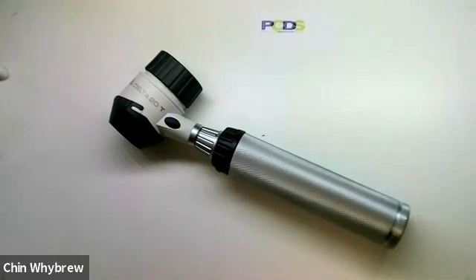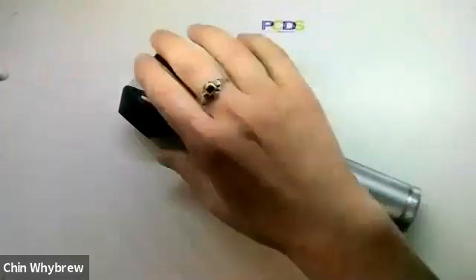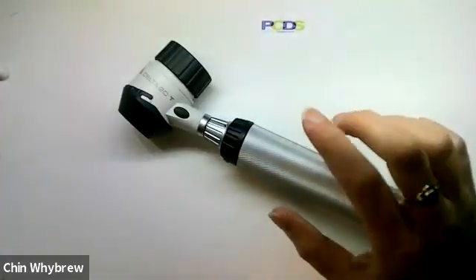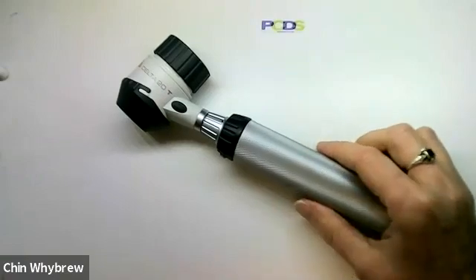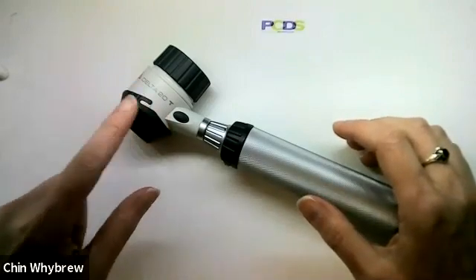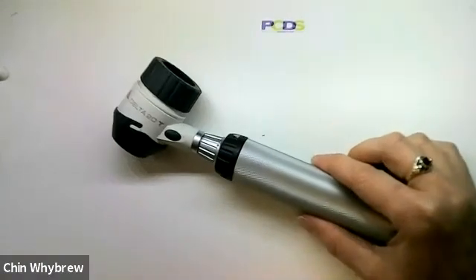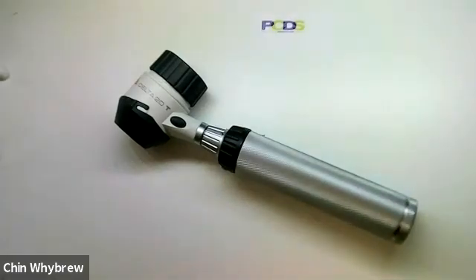The big advantage of the Heine Delta 20T is that it's a very robust piece of equipment, likely to last for years. It's very common that retiring GPs leave these in their desk, either a Delta 20T or one of the previous Delta 20s with two separate end plates — one for polarised and one for non-polarised. If you find one or have access to one, it's definitely worth keeping, as it's a really decent scope used in hospitals quite a lot, though some more modern scopes may be easier for photography.